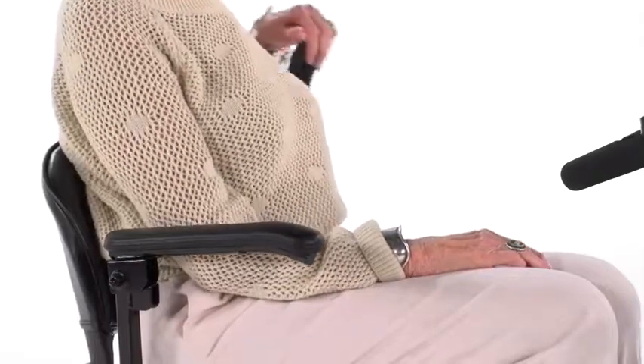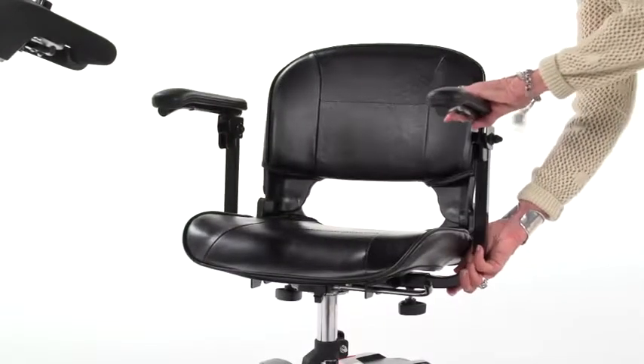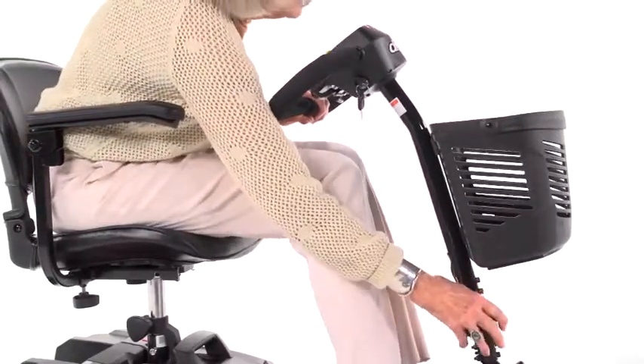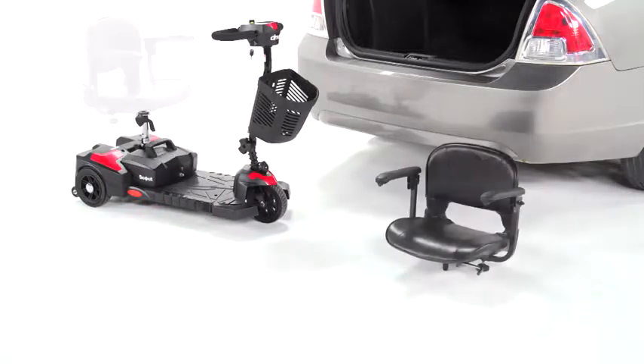The padded armrests flip up for convenient boarding and exiting of the scooter, and the armrest width can be adjusted to best fit the user. Plus, the tiller's angle is adjustable to position the controls in the most comfortable driving position.